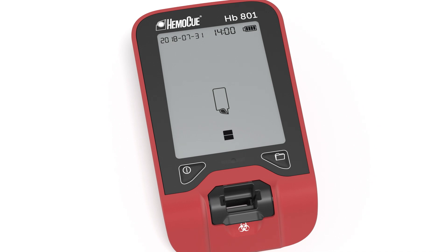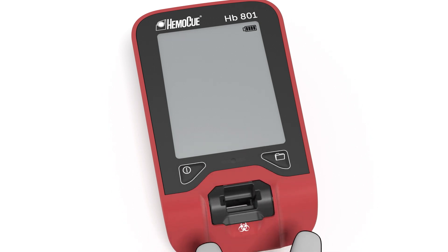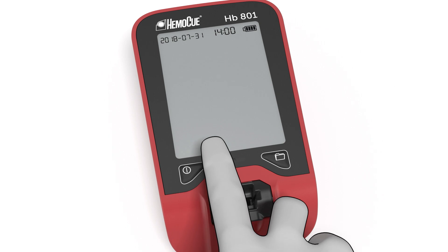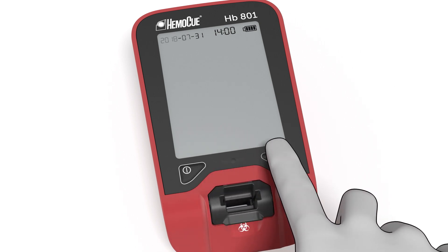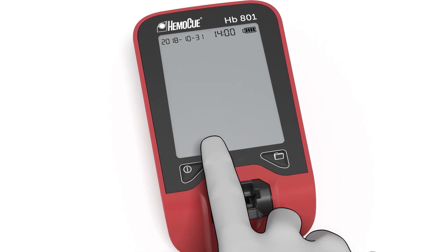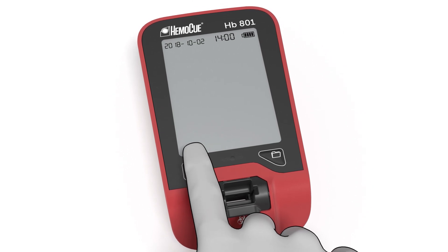Once the analyzer is in ready state, set date and time by pressing down both left and right buttons until the date and time symbols start to flash. To set the correct value, press down the left button. Move to the next value by pressing down the right button, then press the left button again to select the month. Continue like this until date and time has been set.